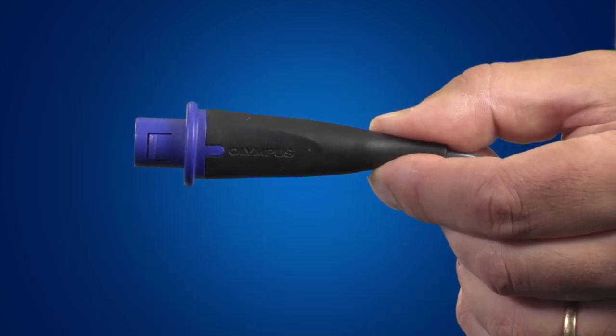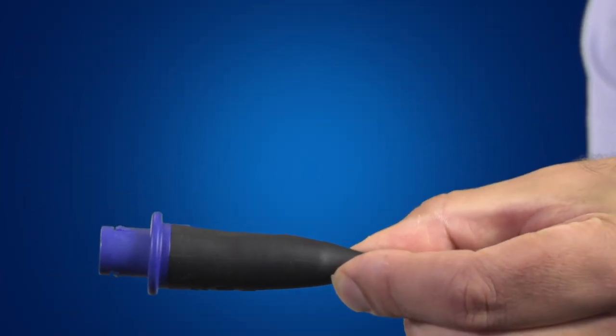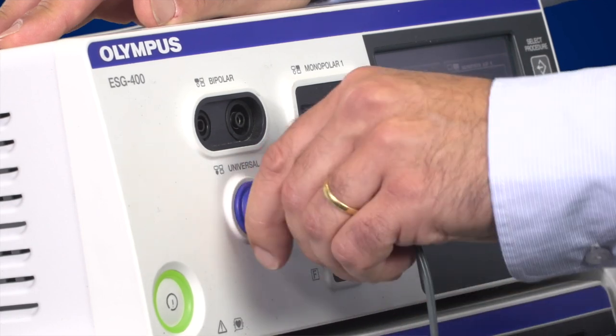When connecting the universal plug to the ESG400, the Olympus sign should be pointing upwards. When removing the cable, do not pull on it — instead, pull on the plug itself.